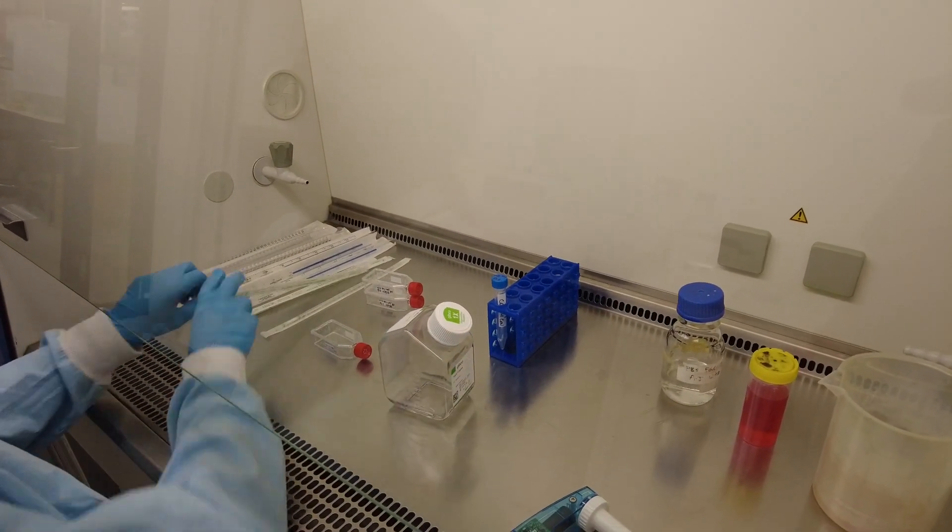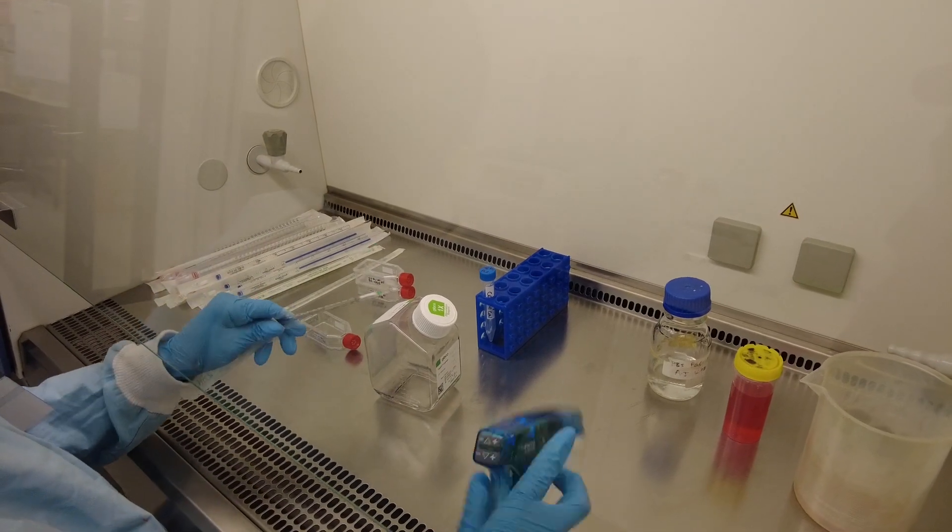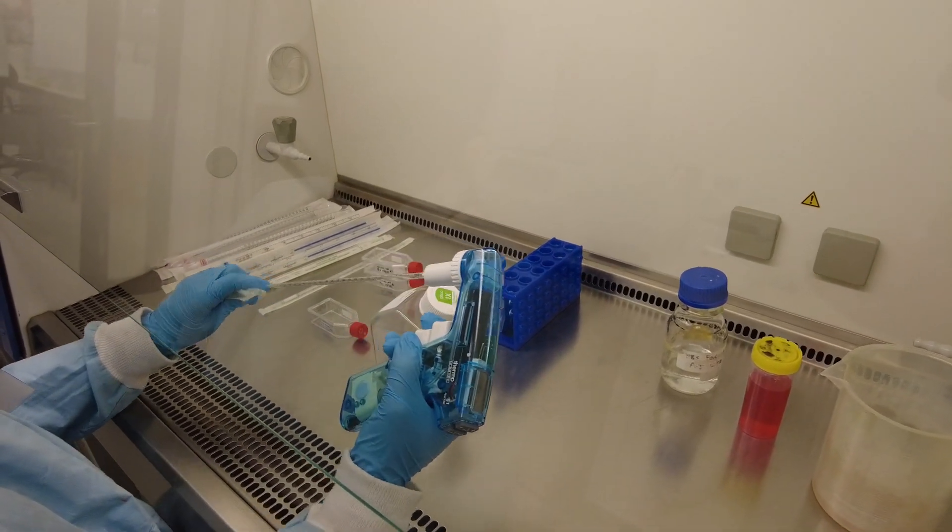And two mil of trypsin. We're going to put it in the incubator for the cells to lift from the bottom of the flask.